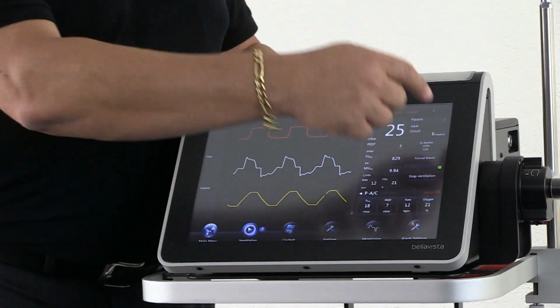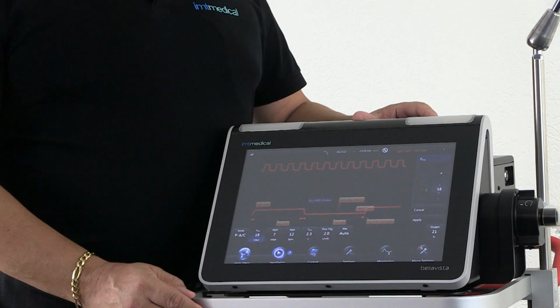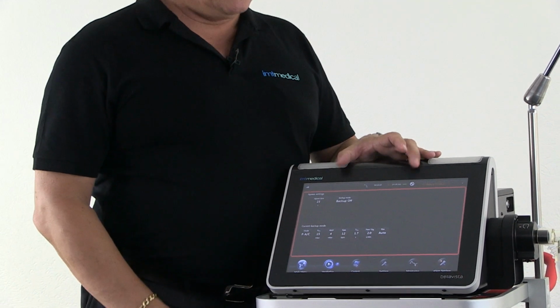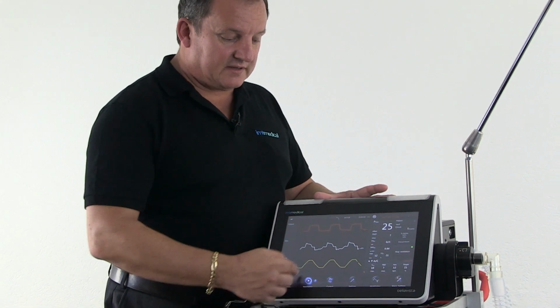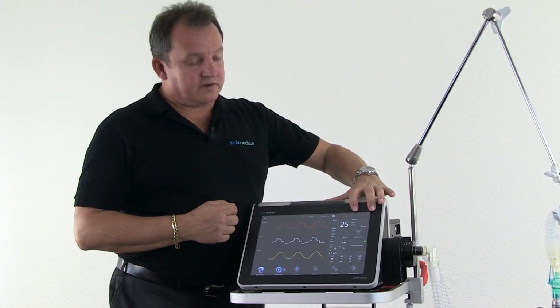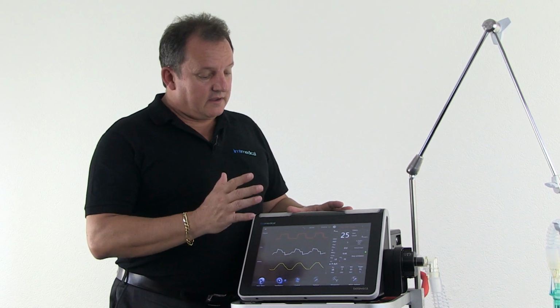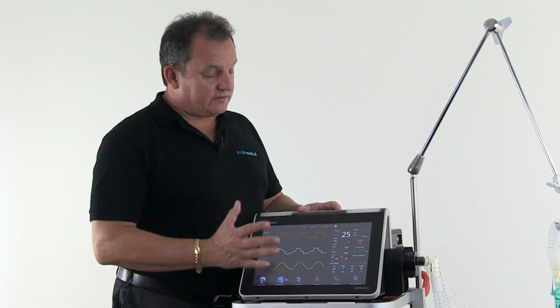I'm going to this screen. Oh yes, I know what this next screen is. That next button is going to be ventilator settings. And because I've used the bellavista for a long time, I know that the last page is always my apnea backup ventilation settings. So now you've navigated through bellavista very effectively. You've started off simply by using the simple ventilation buttons. You've advanced to using the back button. You've got to know the page buttons. And last but not least, you've learned one of the most interesting features of bellavista, that you can swipe through the pages. In this manner, you can use bellavista very efficiently and very effectively at all times.